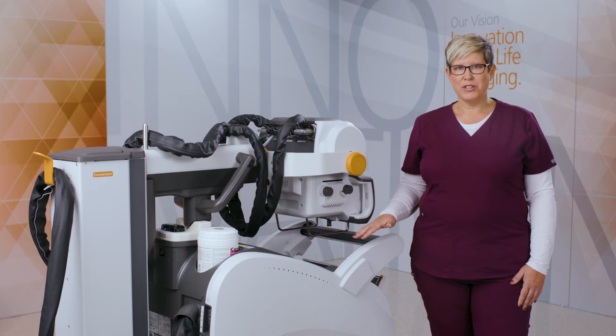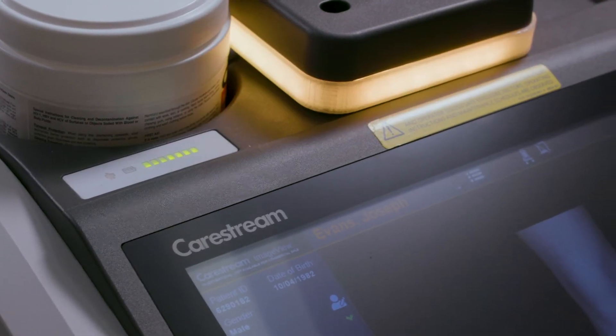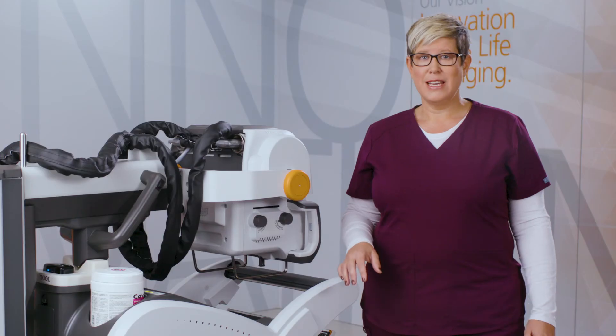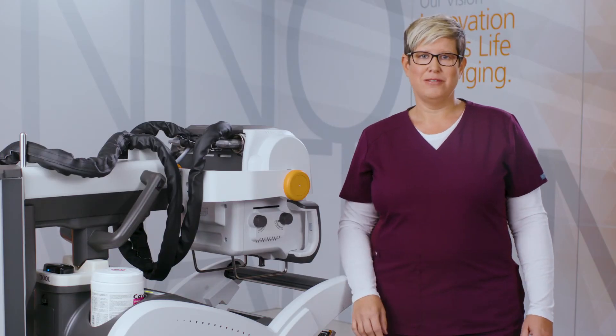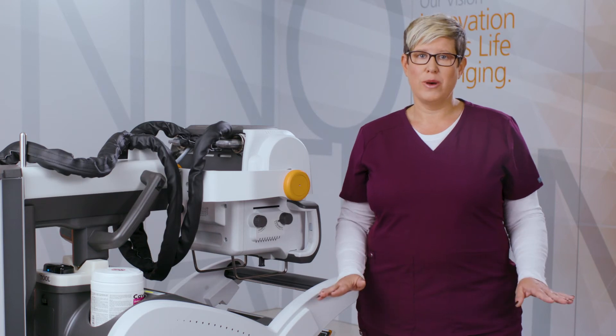Another great feature of Revolution is the functional lighting. LED lighting shows the user's system status for ready, prep, exposure, standby, and e-stop activation. These are the same colors used in our rooms so as to keep consistency among other CareStream equipment.